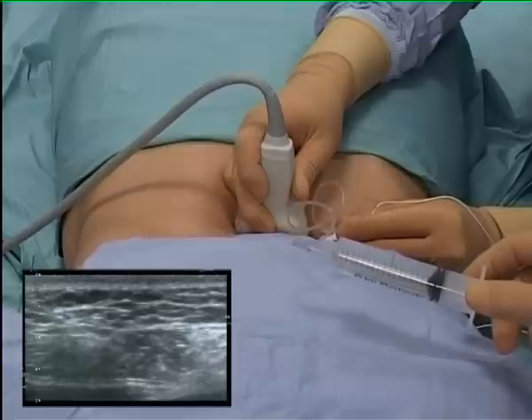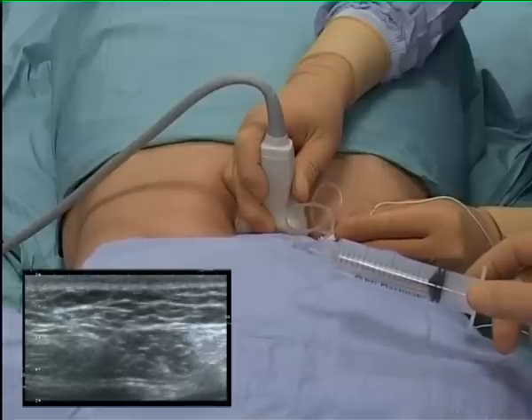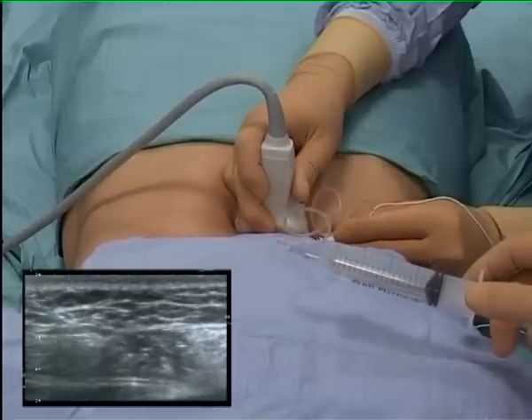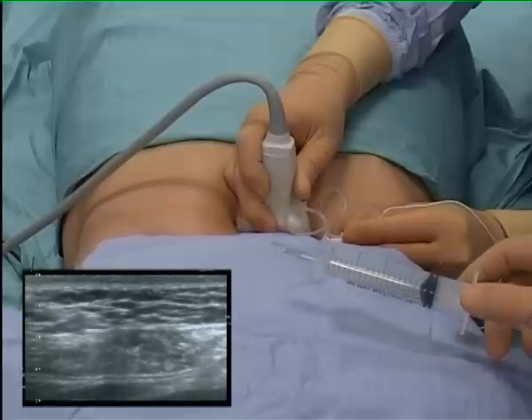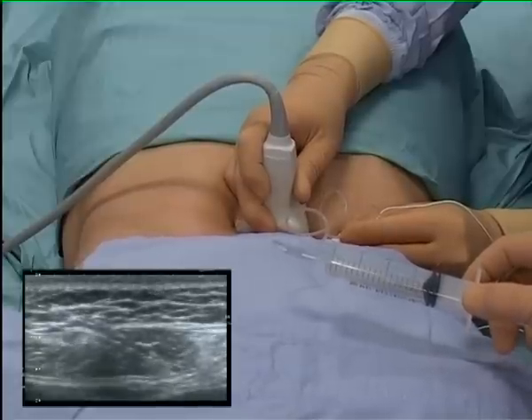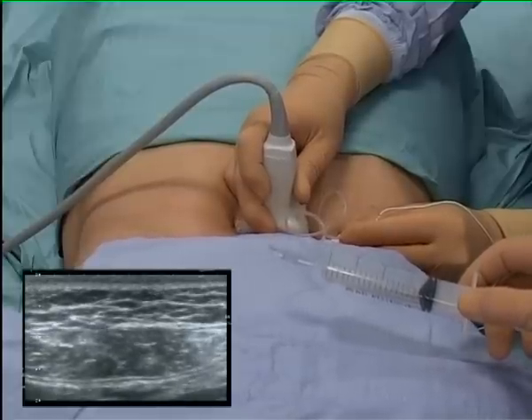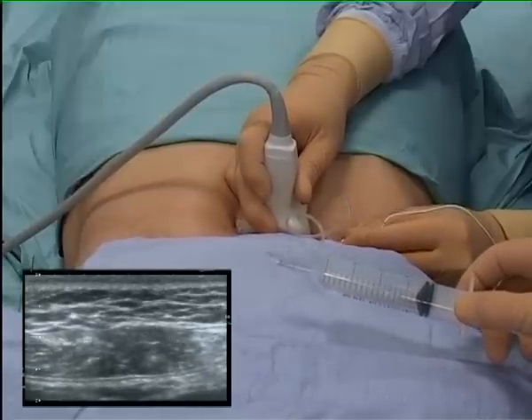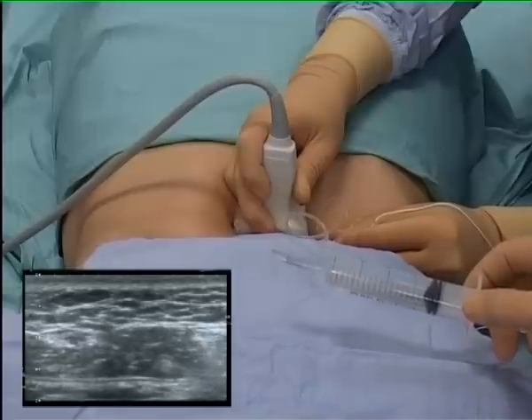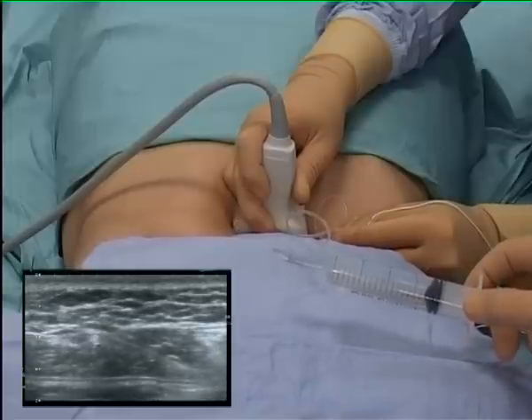The injectate here appears within the substance of the rectus muscle. Therefore, the needle is advanced fractionally further until the test injections confirm spread along the posterior aspect of the muscle.